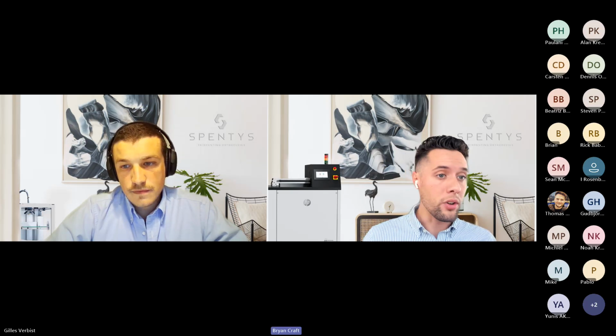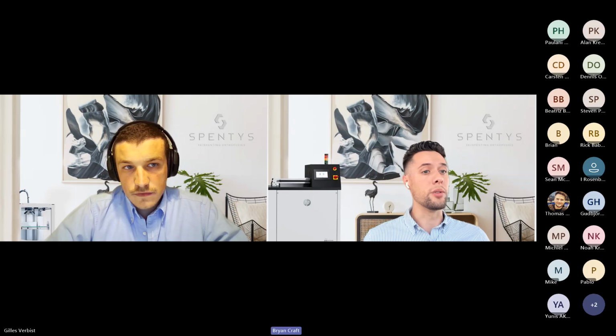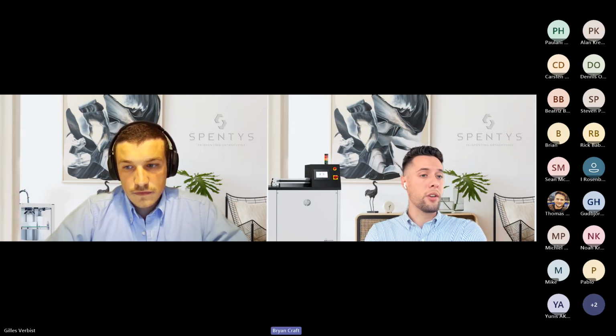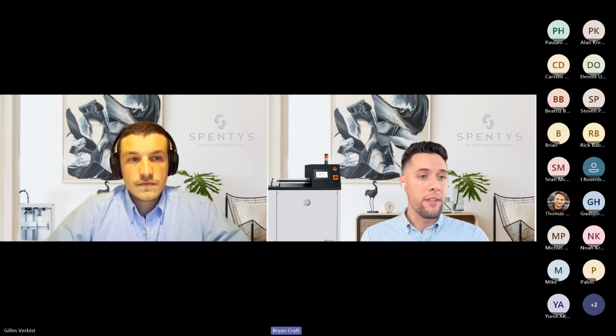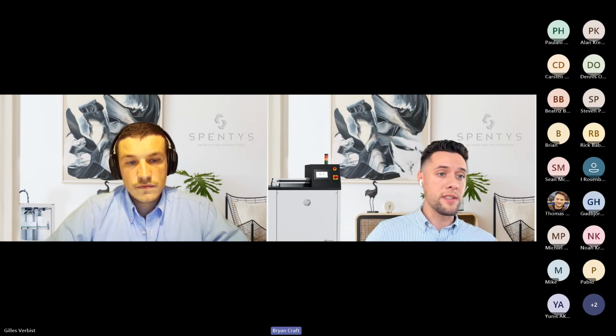But if you have your own printer or you have your own partners that you prefer to print with, you can also leverage our design service, download the file, and send it to your partner. So we're a software company. That's what we want to be. And we want to enable you to access the full added value of additive manufacturing. And if you need print service, we'll offer that for you, and we'll try to be as competitive as possible, a lateral move to your traditional fabricated orthoses today. But if you want to go and buy printers yourself, you're more than welcome.